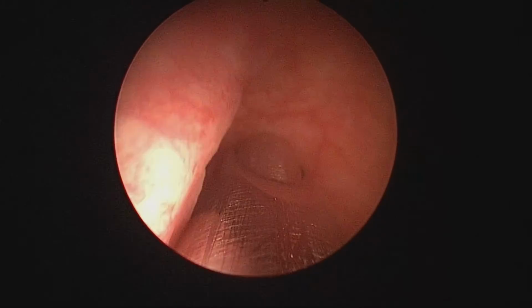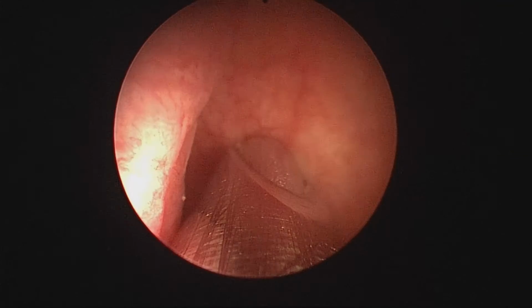That is one of the diverticulums. For a moment, I thought, would it be possible to suck the diverticulum inside the mucosa, inside the bladder, and then morcellate? Just a crazy thought. I thought, let's better not do that. And then, of course, we changed.